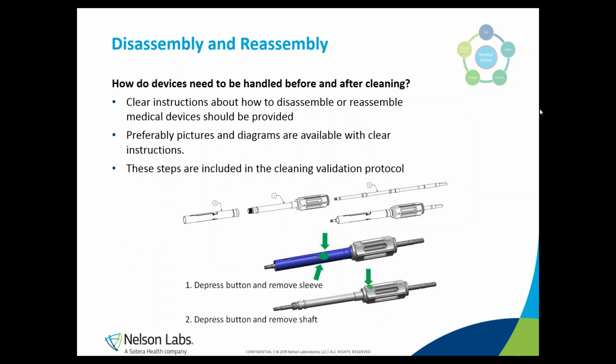Also of great importance is the handling of reusable devices before and after cleaning, and especially when the devices can be disassembled. So it is very important to know how exactly and when in your reprocessing cycle devices need to be disassembled and reassembled again. Clear instructions, preferably with clear pictures and diagrams, should be provided and included in all processing validation protocols, as well as in the final instruction for use manual that will be available for the healthcare facility, so the end user of your device.